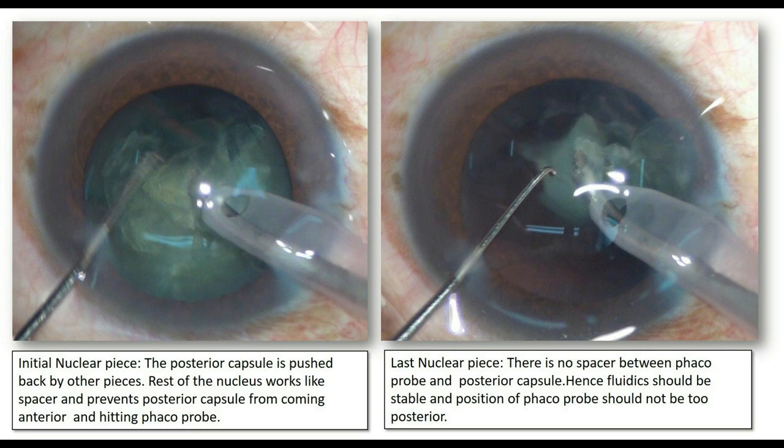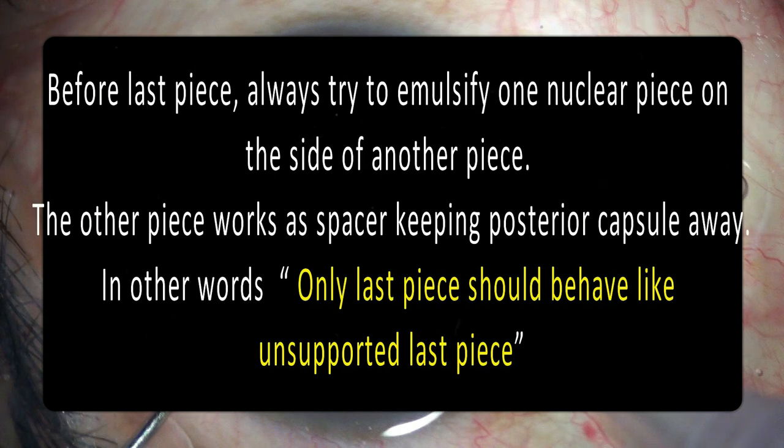When it comes to the last nuclear piece, there is no spacer between the FACO probe and the posterior capsule. Hence, the fluidics should be stable and the position of the FACO probe should not be too posterior — it should be central. These are very important points to understand to avoid complications with the last piece. Before the last piece, always try to emulsify one nuclear piece on the side of another piece; the other piece works as a spacer keeping the posterior capsule away. Only the last piece should behave like an unsupported last piece — this is a very important statement to remember.